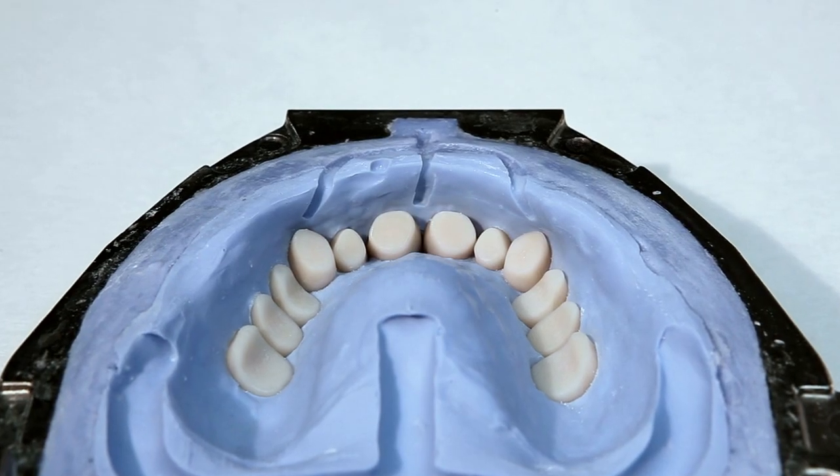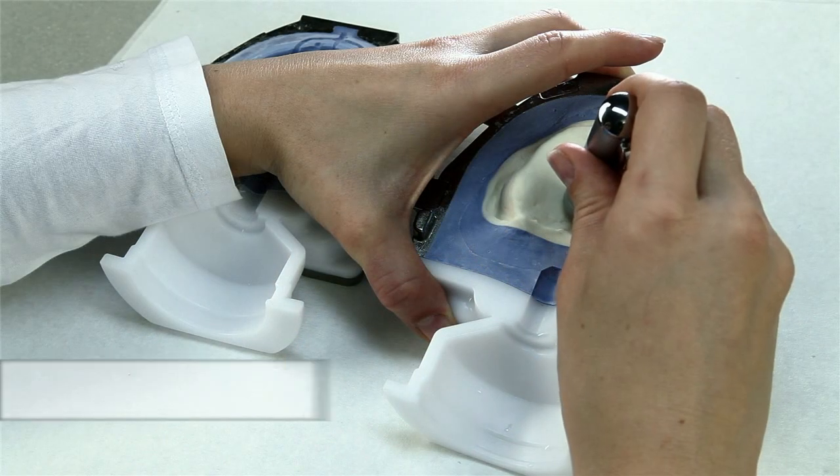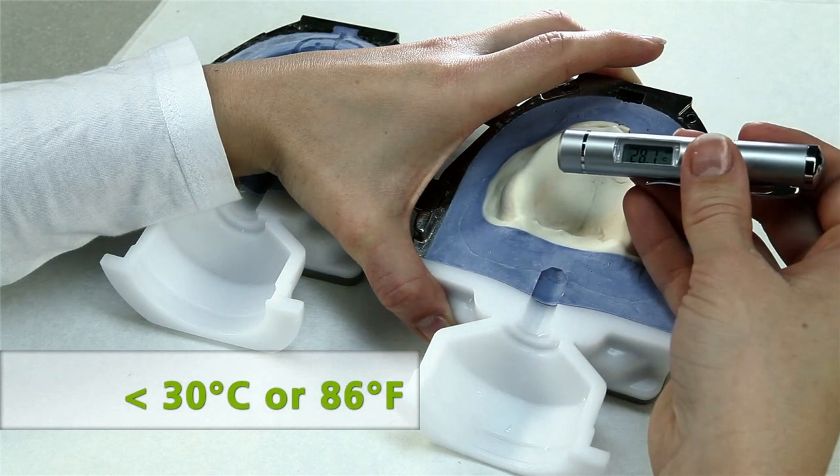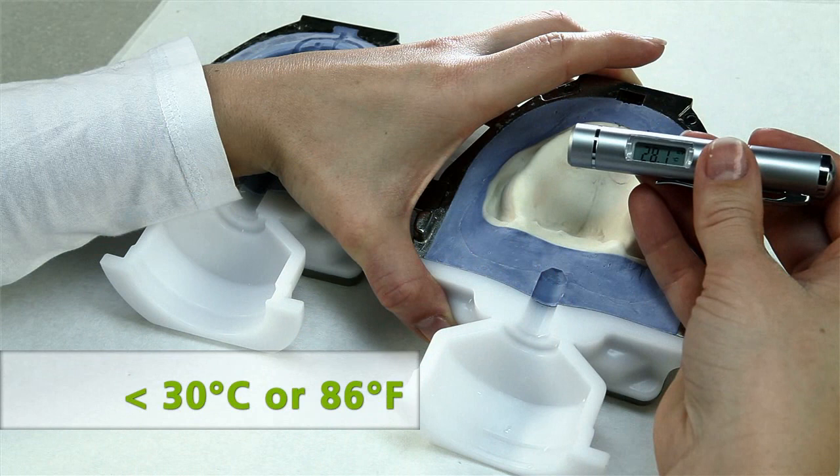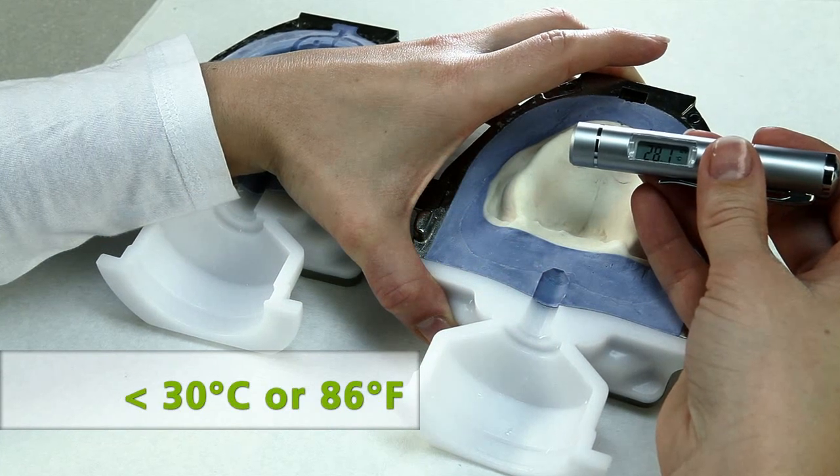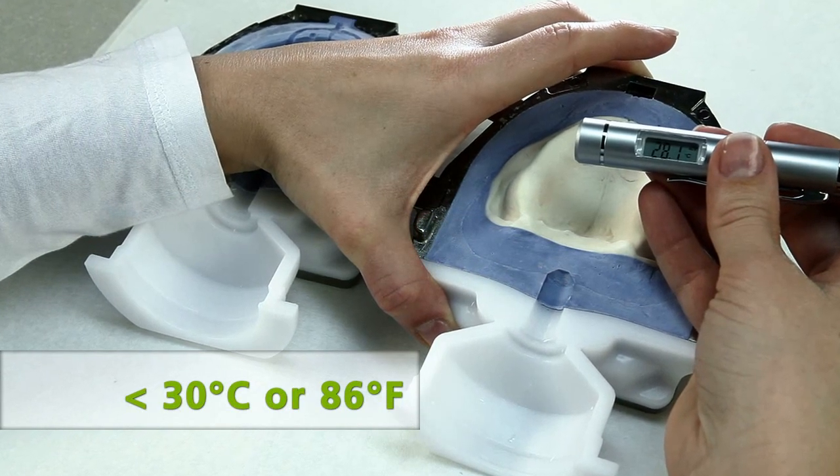Before isolation, cool the flask halves to below 30 degrees Celsius or 86 degrees Fahrenheit using air or clean cold water. Use the infrared thermometer supplied to check the temperature.